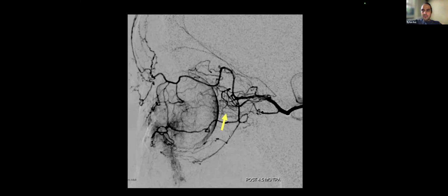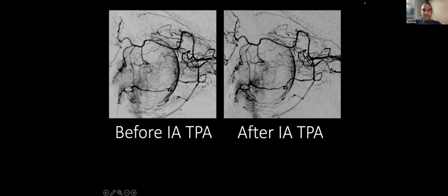And, if you don't believe it, I put these images side by side. And here it is before intraarterial TPA, and this is after intraarterial TPA. And now when you see here, obviously there has been a change. No doubt about it. The vessel reopened.